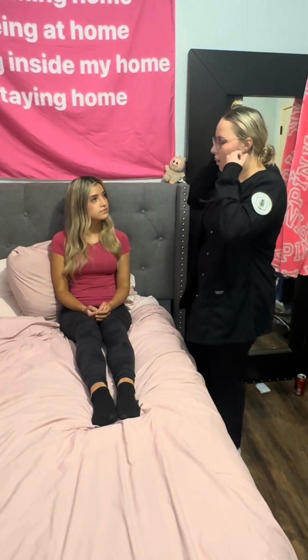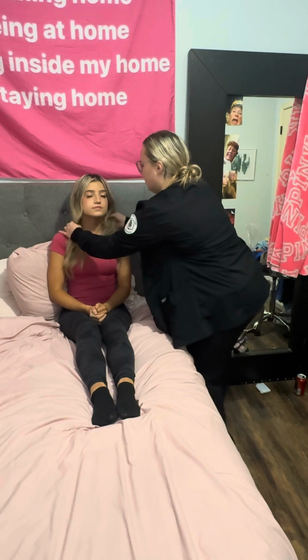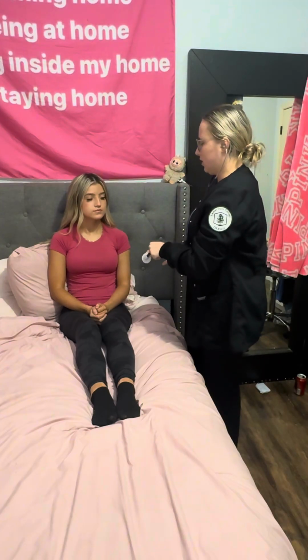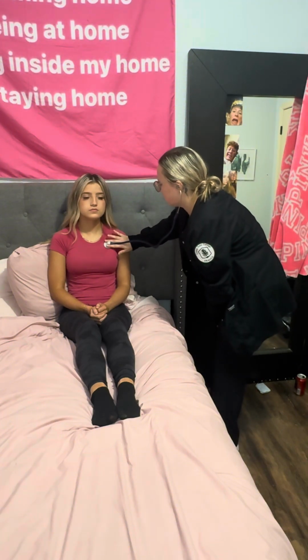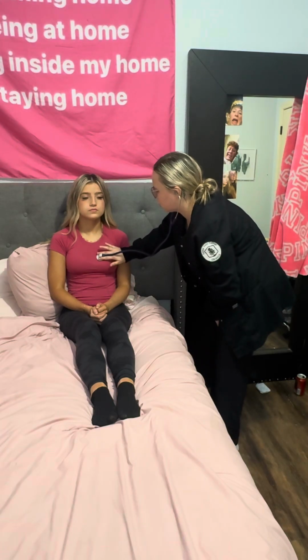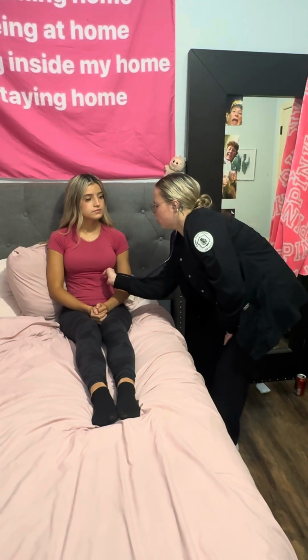Alright, good. Now I'm going to check your hand grips. So just squeeze my fingers. Alright, nice and strong. Now I'm going to go ahead and check your chest area. I'm going to use the diaphragm of my stethoscope. We're going to get started with the second right intercostal space, which is your aortic. Then we're going to go right across over to the second intercostal space on your left side, which is the pulmonic. Your third intercostal space, which is your Erb's point. Your fourth intercostal space, which is your tricuspid. And your fifth intercostal space, which is your mitral.